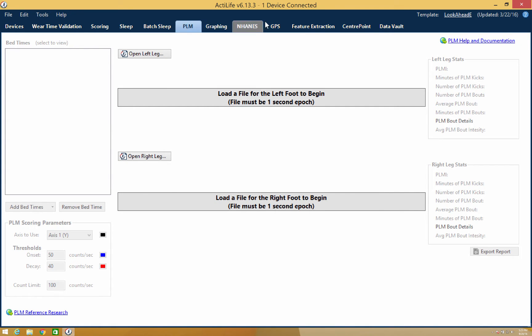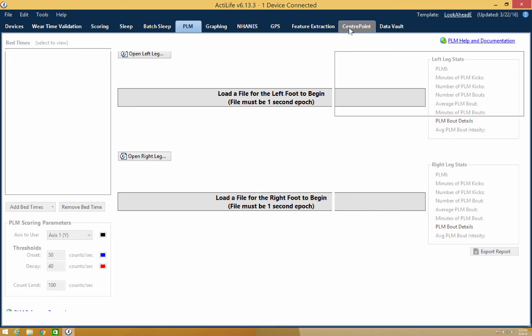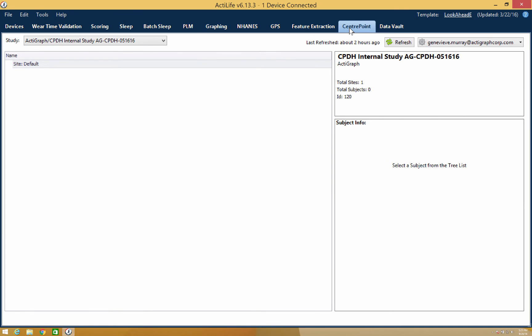The final tab is the Center Point tab. This tab allows you to link your Center Point study to ActiLife, where you can perform your post-hoc analysis.